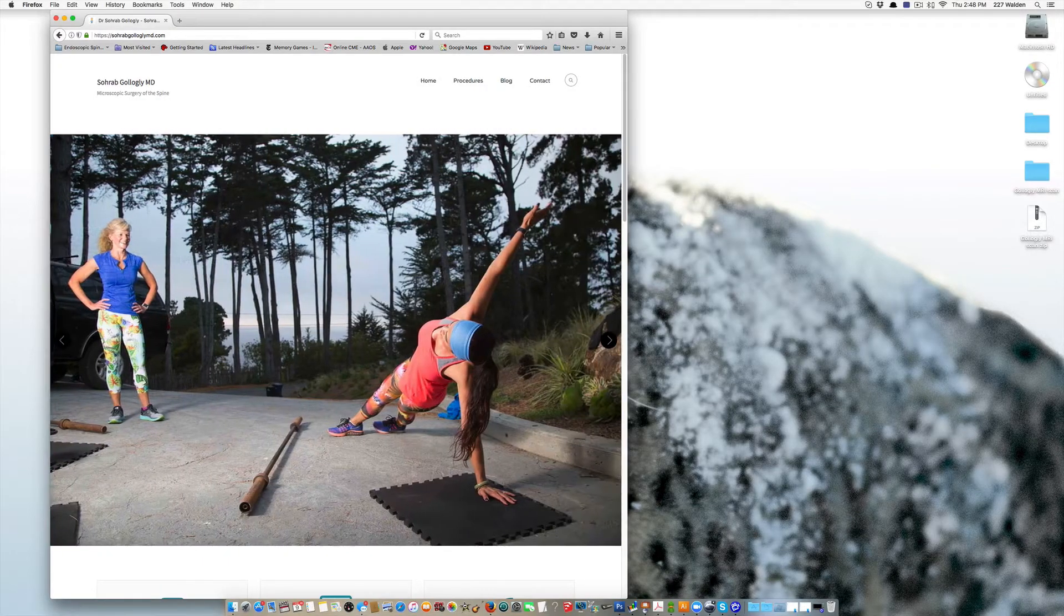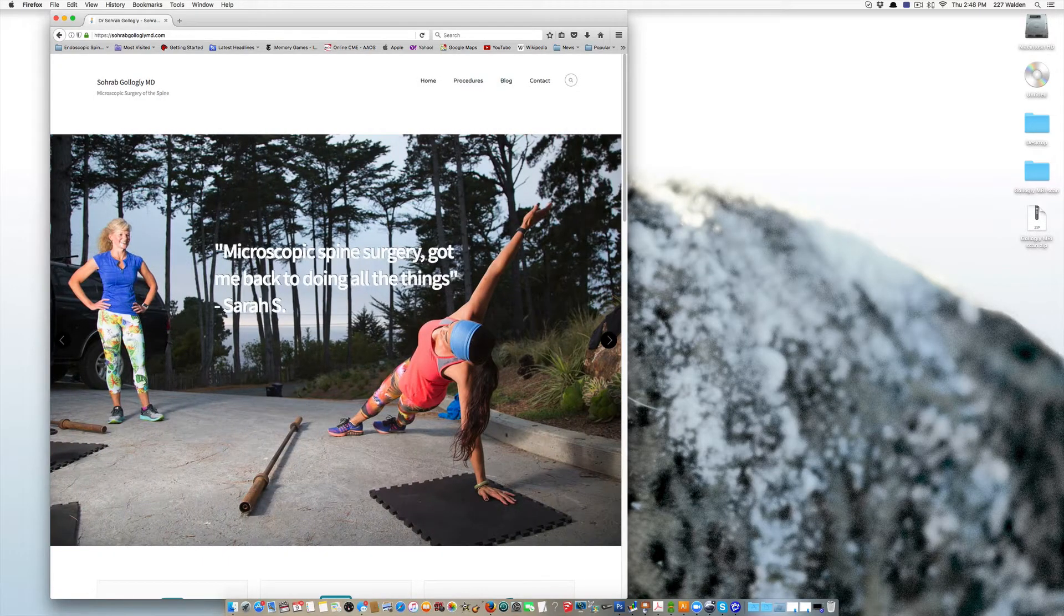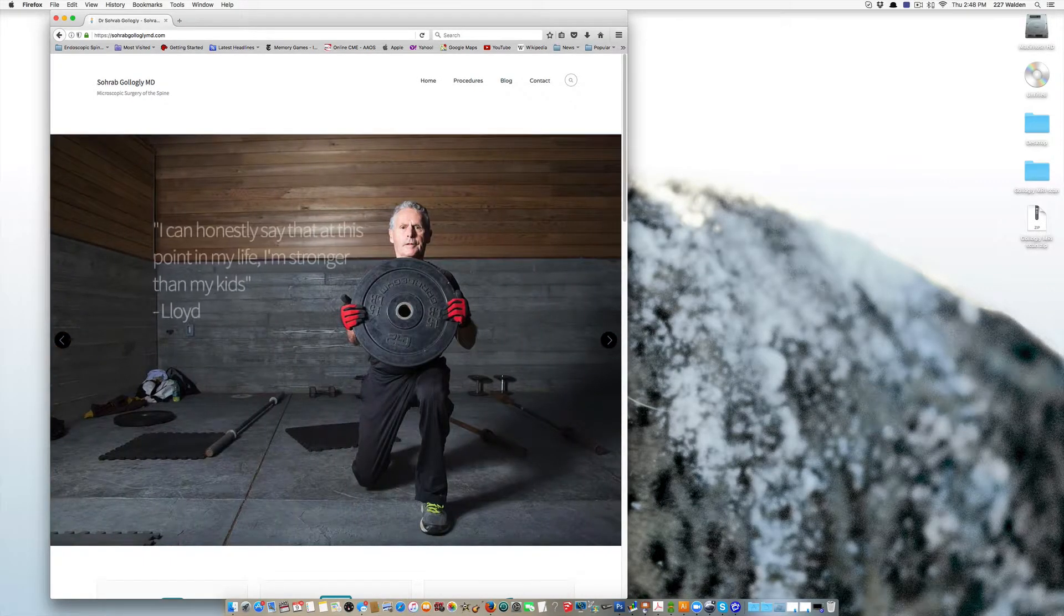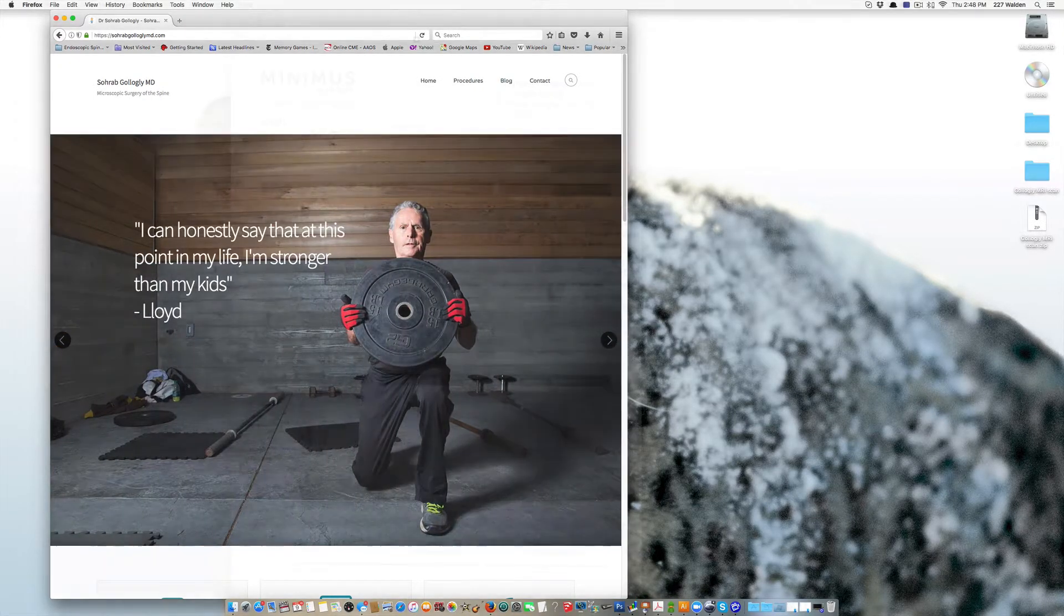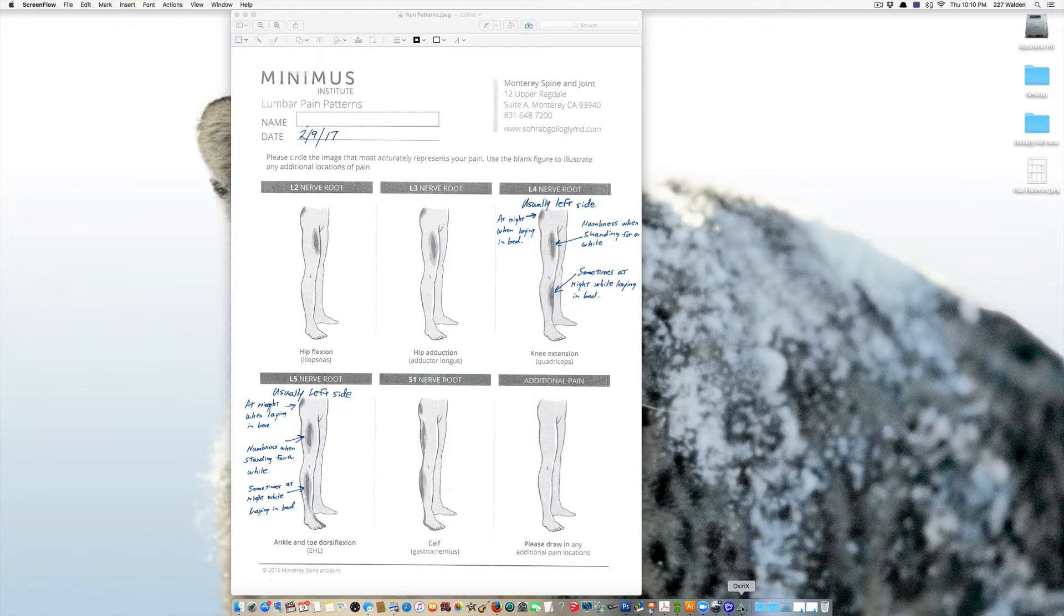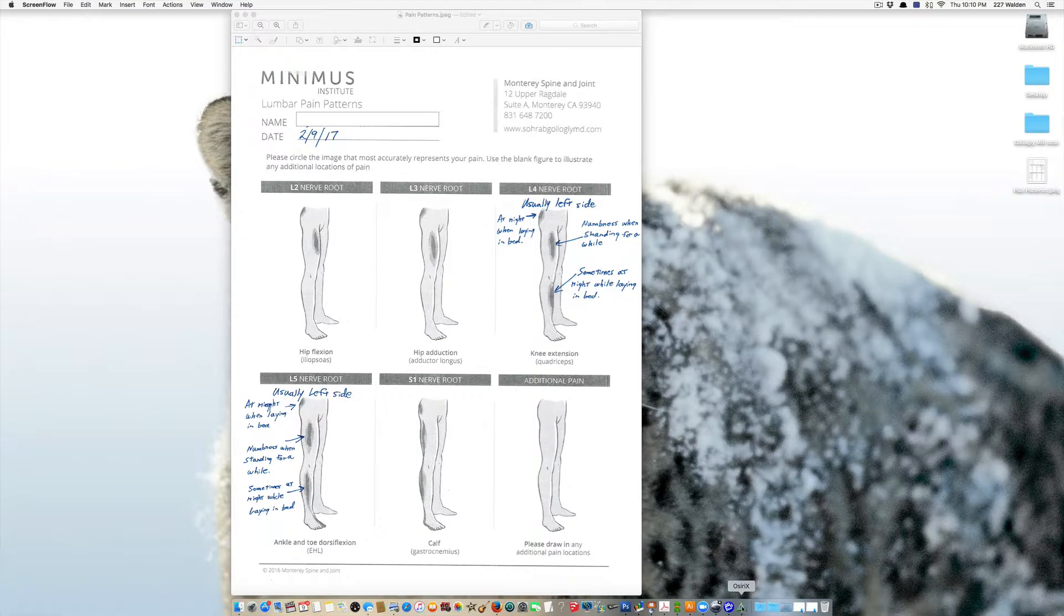I specialize in microscopic decompression of the spine and I'm going to show you what I do when I review an MRI scan for someone.